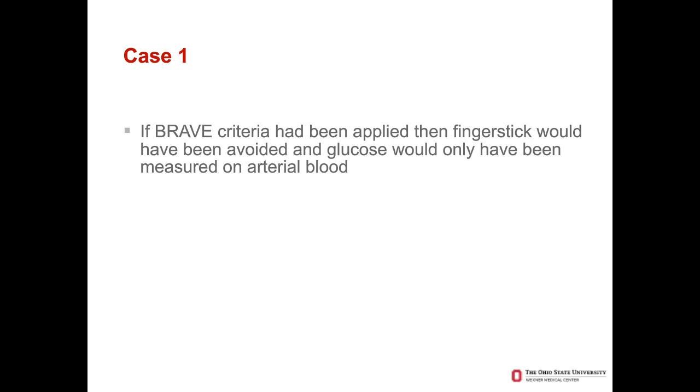And you're probably sitting here saying, well, what is the BRAVE criteria? That's what I'm going to go through in the next few slides, and then I'll show you some applications of it. The key here was to develop a systematic approach to determining which patients could have finger stick glucose monitoring and in which scenarios we should use arterial blood for the point of care testing instead of using the finger stick. So what is BRAVE criteria?